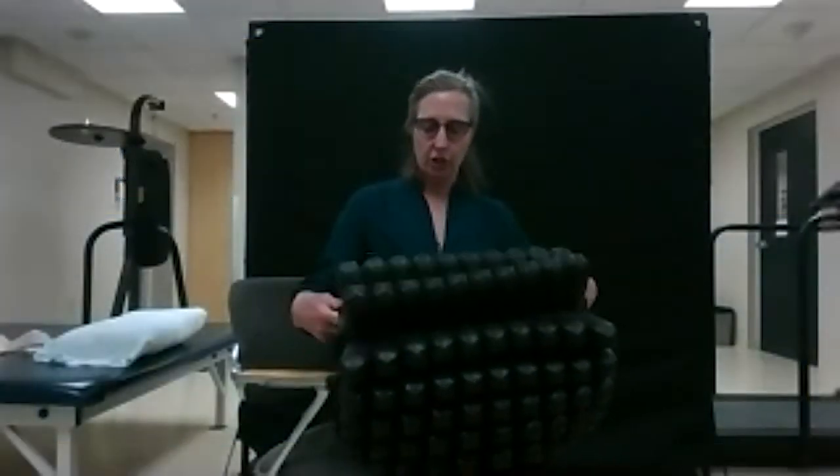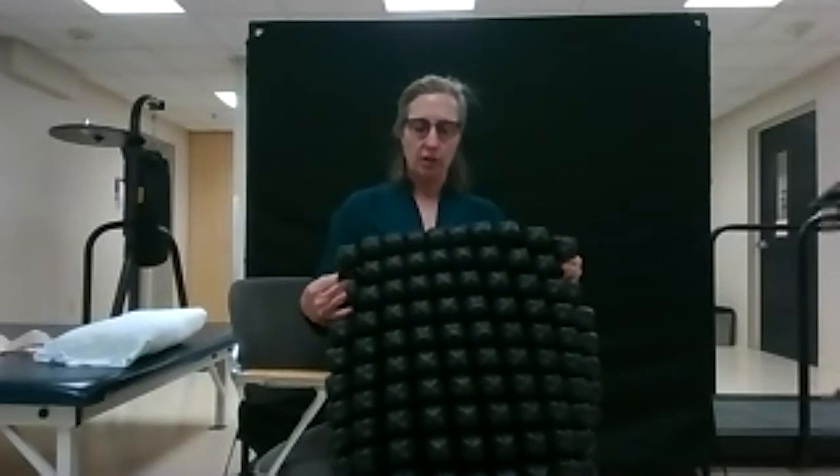Now I'm going to go over wheelchair cushions. This is often a very difficult part and can provide extreme comfort or you can be extremely uncomfortable. So I want to make sure that you understand your choices. Your choices are air, gel, or a combination.